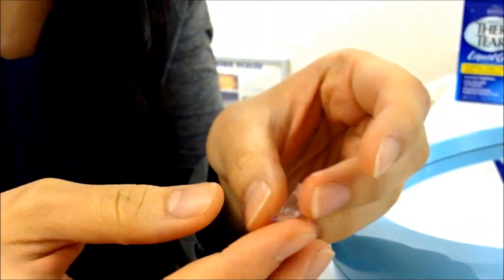Using the middle finger from each hand, hold the lids back by the lid margin near the lashes. Position your head so that you can see the white of the eye above and below the coloured part. This ensures that the gap between the lids is wide enough for the lens to fit through.